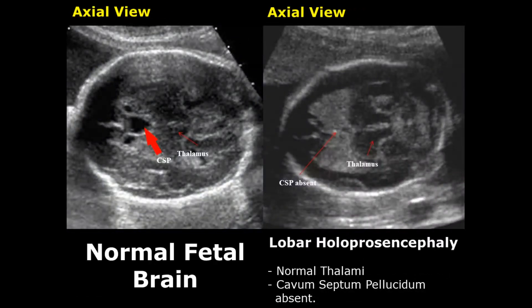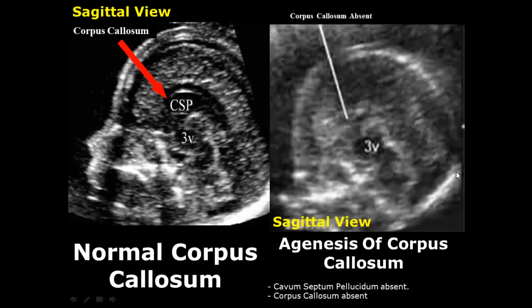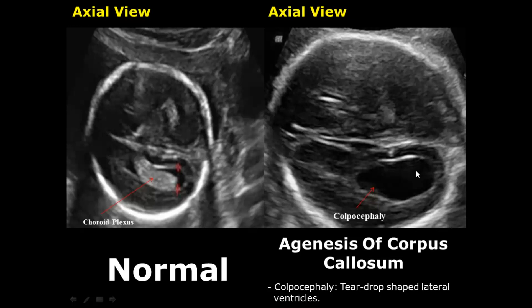Lobar holoprosencephaly is the least severe form — in this, the thalami are normal but the cavum septum pellucidum is absent. In agenesis of the corpus callosum, the corpus callosum which divides the cerebral hemispheres is absent, and the cavum septum pellucidum is also absent. One classic sign is colpocephaly — a teardrop-shaped lateral ventricle configuration in which the ventricles are dilated and have a teardrop shape, different from other types of ventriculomegaly.